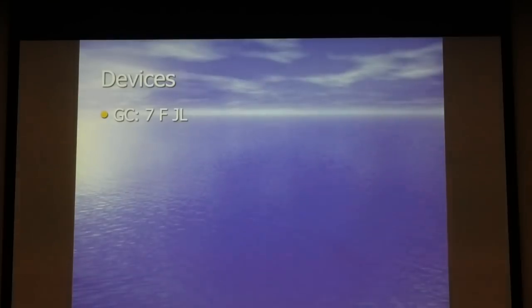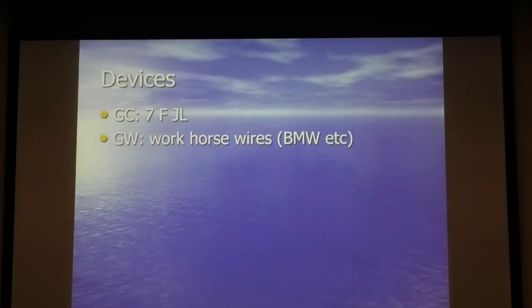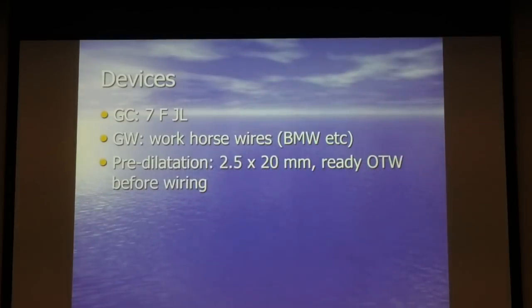Guide wire, workhorse guide wire. We should avoid really traumatic guide wires like hydrophilic wires because they can cause dissection without knowing. Predilatation, long balloons. Don't use short balloons when you have critical lesions. Get them ready on the wire because when you cross, the patient may really deteriorate.